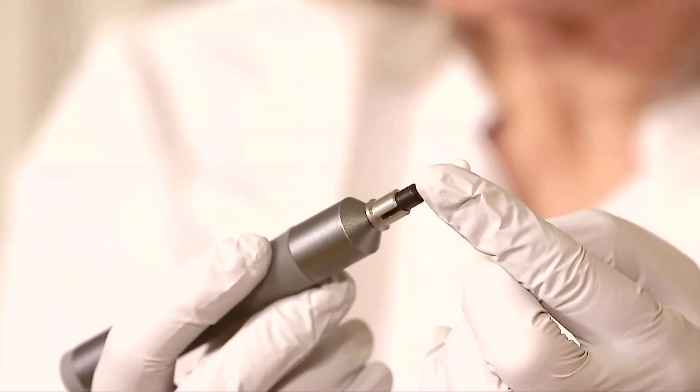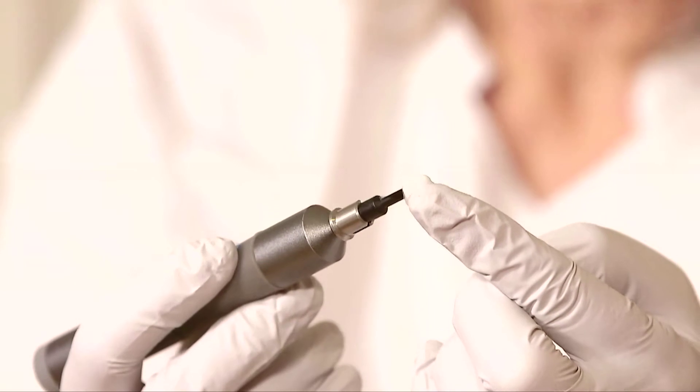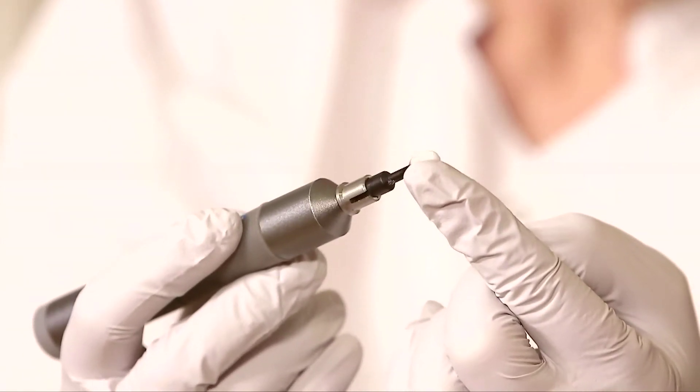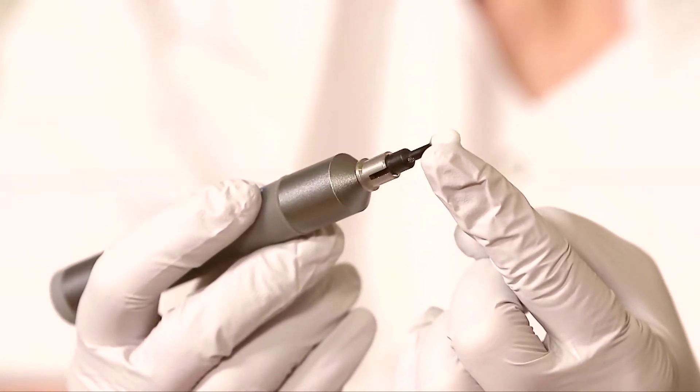That lifts off all the biofilm and does a deep clean of the lid margins, taking away all these dead cells, oils, things that you do not want on your eyelids, because they're going to cause inflammation and predispose you to discomfort, irritation, dry eyes, and chalazia.